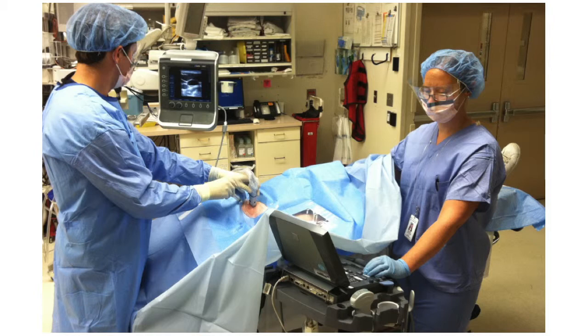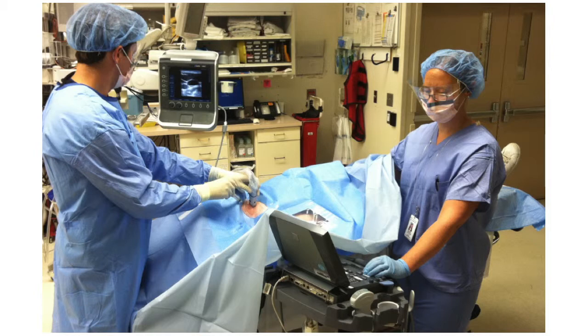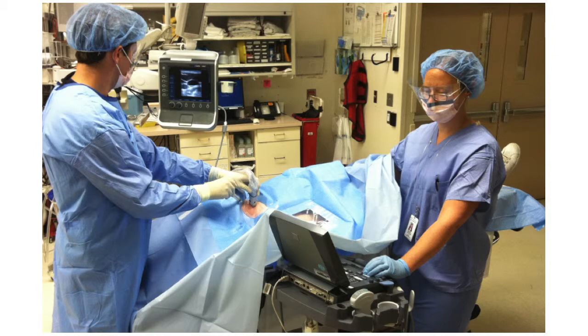This slide demonstrates the technique. The first operator is at the head of the bed, placing a central line using standard ultrasound guidance by visualizing the finder needle as it enters the jugular vein. The second operator is standing on the patient's right with a probe on the patient's abdomen. This is done under the sterile drape.